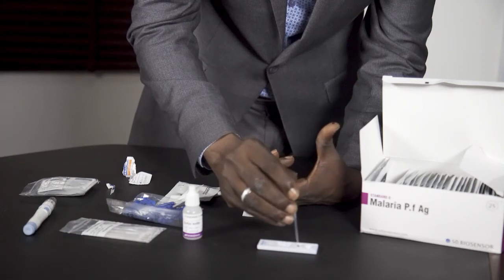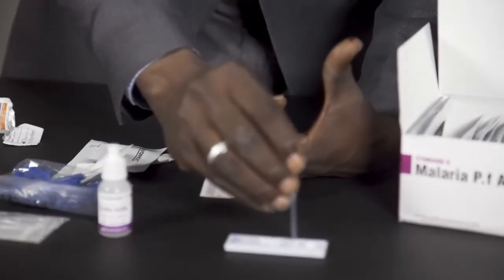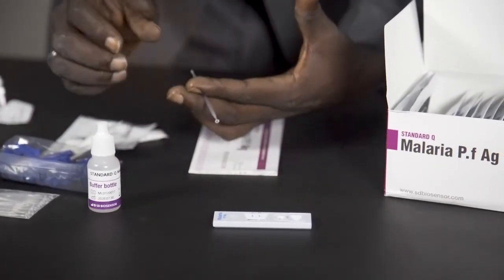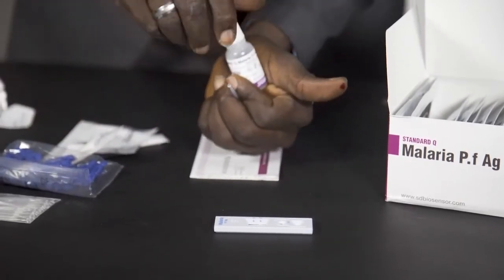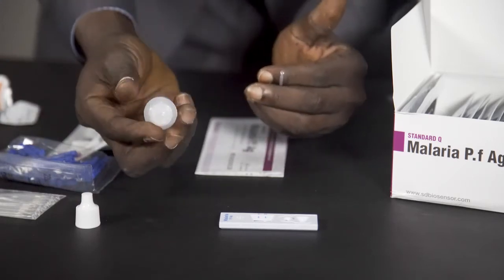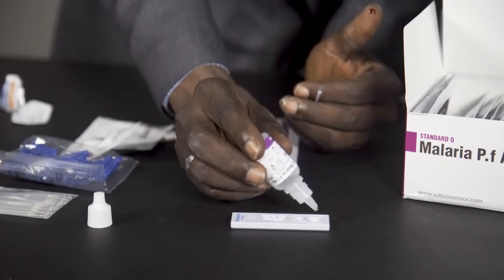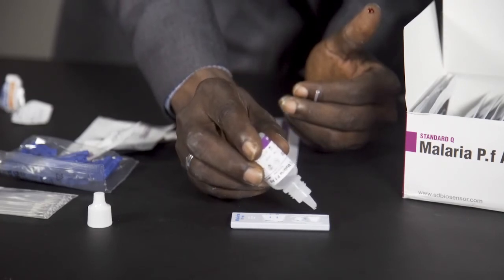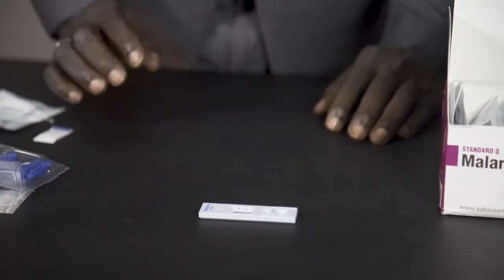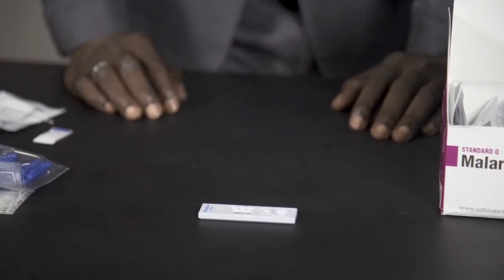Then you put it in the well and press it down. Now you apply three drops of the solution. You read the results within 15 minutes. Do not read the results after 30 minutes.